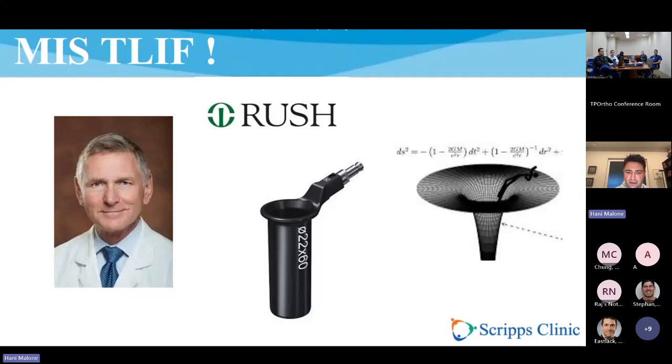And there are certain retractors that are pedicle based now that are sort of hybrid MIS TLIFs, where you put in the pedicle screws, and then you can attach these retractors to the pedicle screws. I would say they're better than the traditional midline takedown, but they're not really as minimally invasive as a tube.